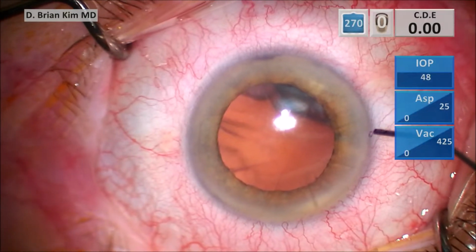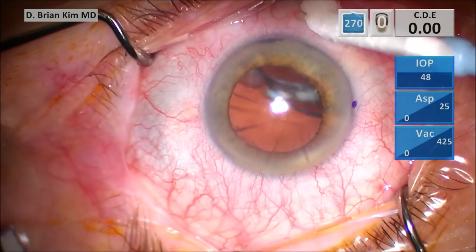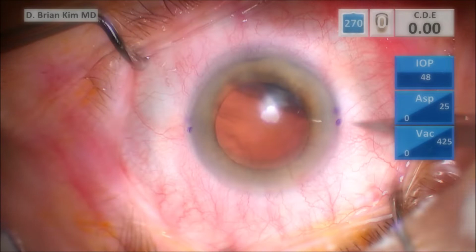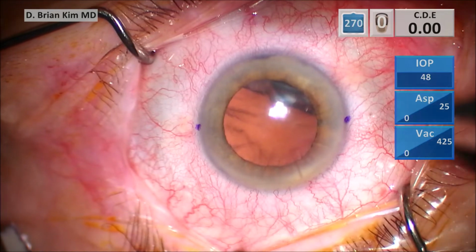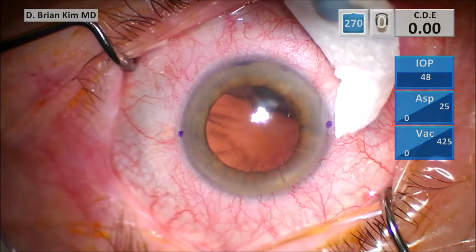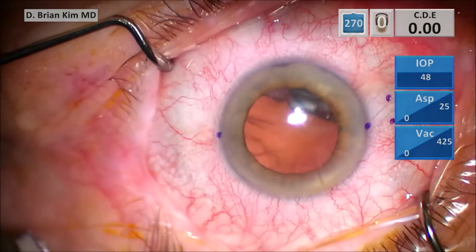So I'll go ahead and use a pre-inked cannula. I mark the limbus, and then I'm finding 180 degrees apart, making sure the conjunctiva is dry with a Weck-Cel sponge, and then marking 180 degrees apart on the other side. And then these are the fixed caliper markers, 2.5 on one side, 2.0 on the other side by Epsilon. I'm marking posterior to that mark 2.5 millimeters in a radial fashion, and then 2 millimeters adjacent using the indentation, drying the surface, and then using that cannula that's been pre-inked, and then quickly marking those spots with the ink.